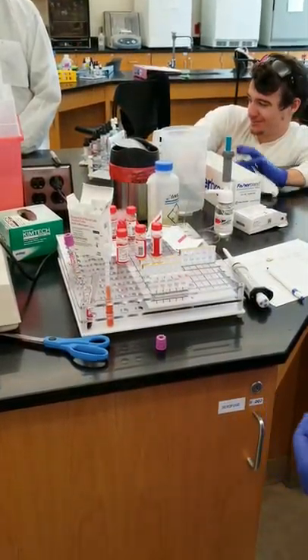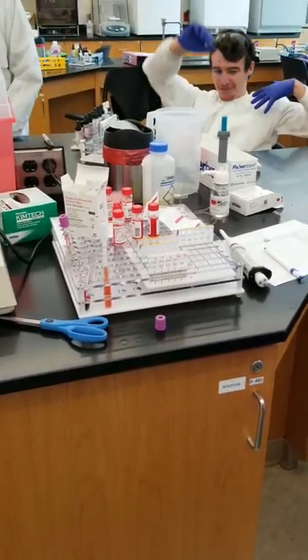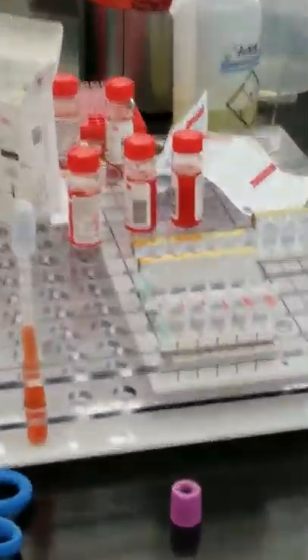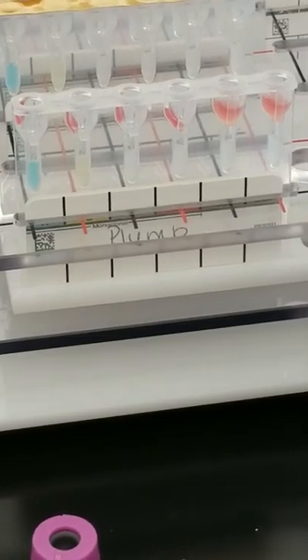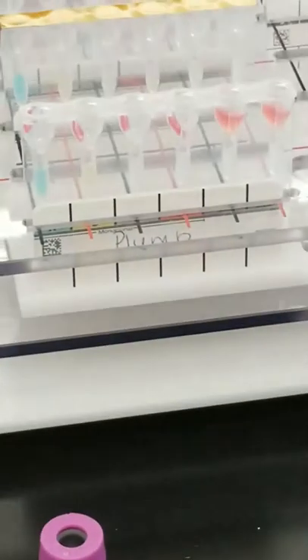Although they do tell you from ortho that they like to have a control with all of the patients, just in case you have some kind of a fibrin. So you have your cells. We've got our A and B cells and our plasma for our reverses. We've got our screen incubating.